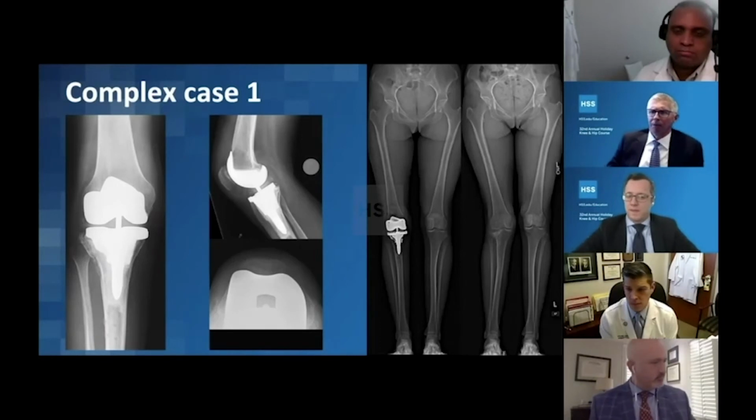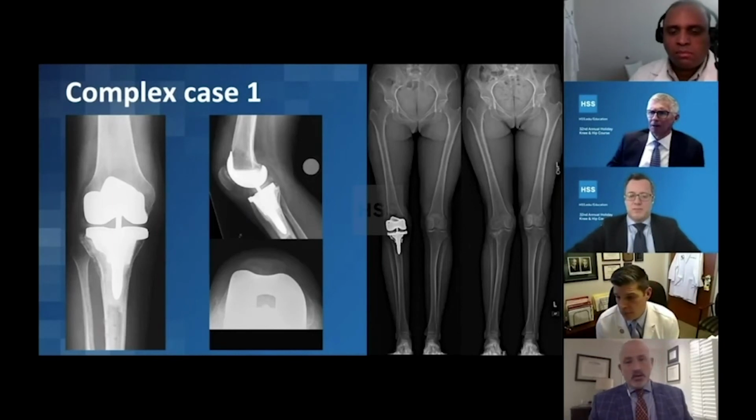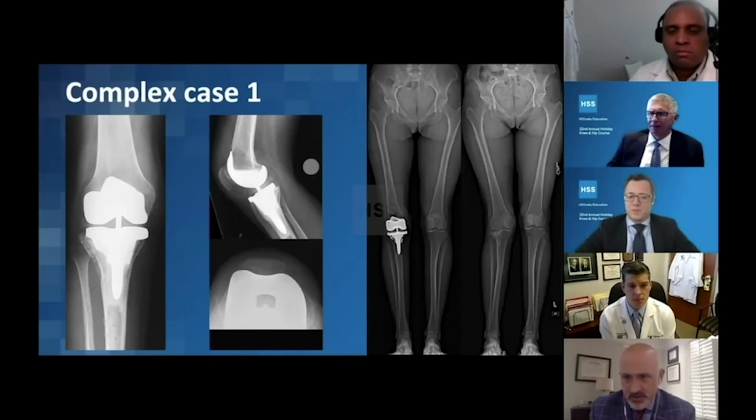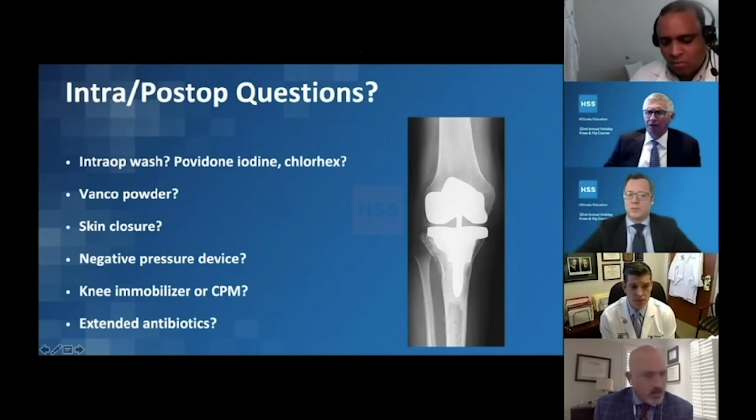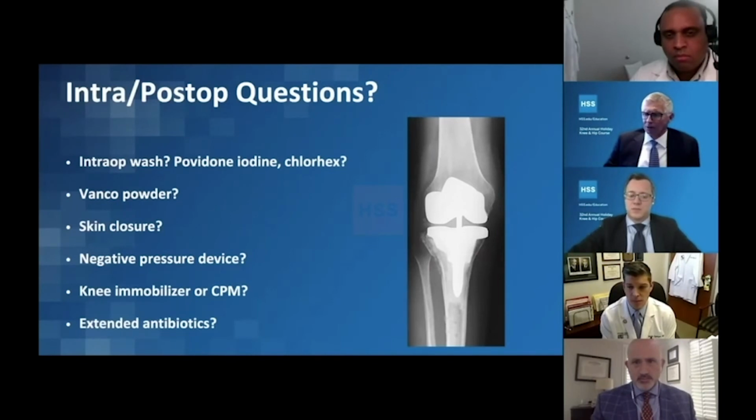There's a question in the chat room about proprioception in these fractures. Jonathan, any thoughts, or Mike or Brian? Yeah, that they're with high energy. I read the text. That's actually educational to me. It sort of makes sense. I still would probably make an intraoperative decision about constraint use, but it's a good thought. I think we have so many options in terms of constraint these days that you don't have to go to the most rigid CCK type design. I don't think anyone would probably do a CR knee here, but there's PS pluses and a little bit more constraint than the standard PS, but you don't have to go to the most rigid CCK design either. So I think we have lots of good options. And it's a game day decision, I think, intraoperatively.